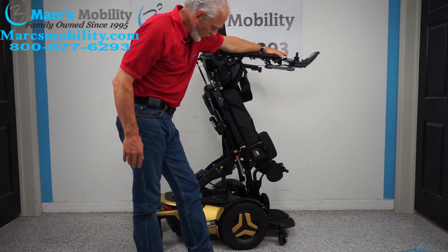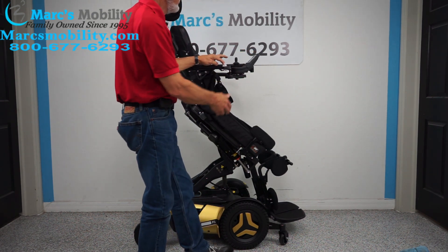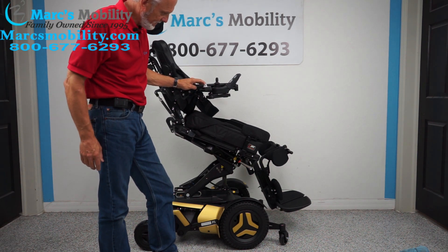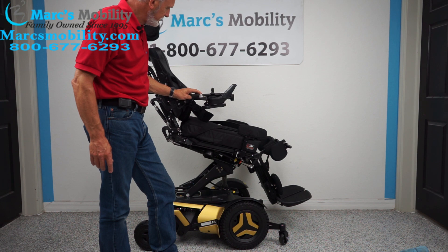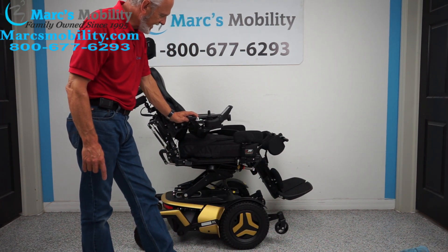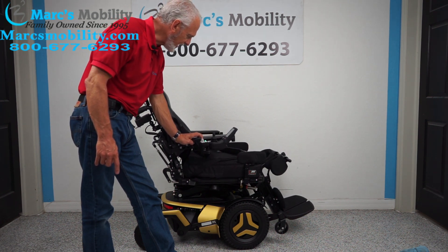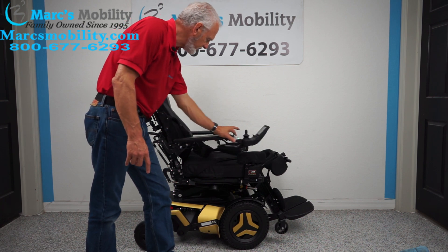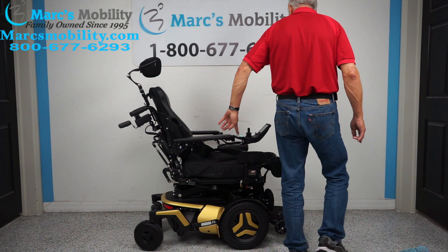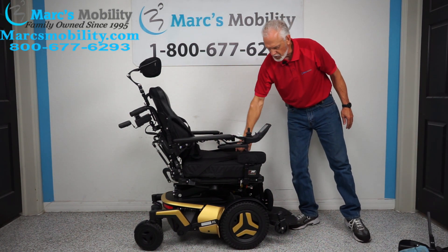We're going to turn the power back on and bring the seat back down. While it's going down, let me talk about the swing-away joystick. The joystick was sitting here, and now it's here — this enables you to get a lot closer to a dining table. You'll see the seat coming back to a standard position, the wheels coming off the ground, and the seat going all the way down. Once your loved one is sitting, you can take the knee brace off. You can still leave the chest strap if needed, and you also have your lap belt.